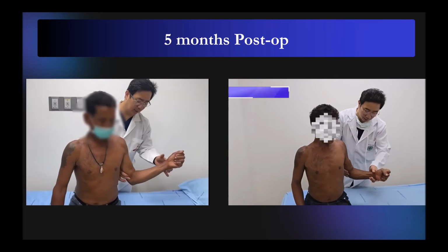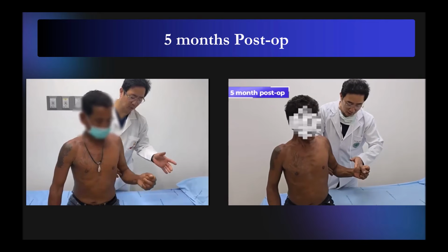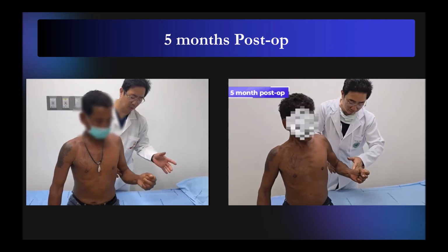And also the external rotation is better because I make a very big graft over the infraspinatus, and I also repair my infra to my graft. So it's not that perfect, but the patient has no lag sign. So for me, if the patient has supra-infra, I prefer to make a big SCR.